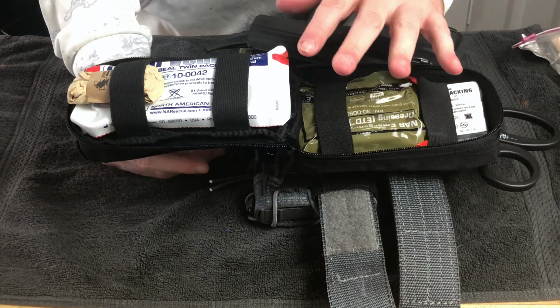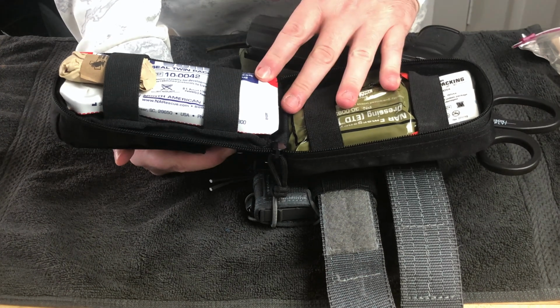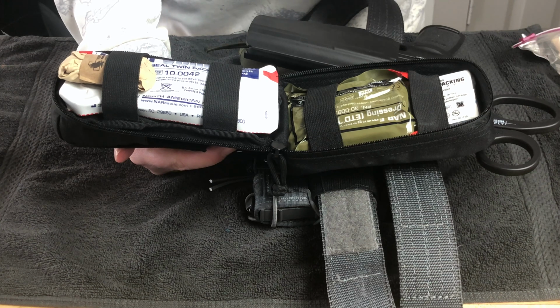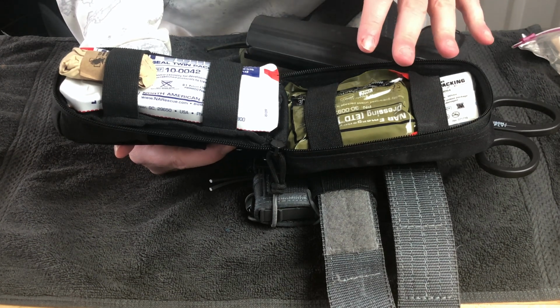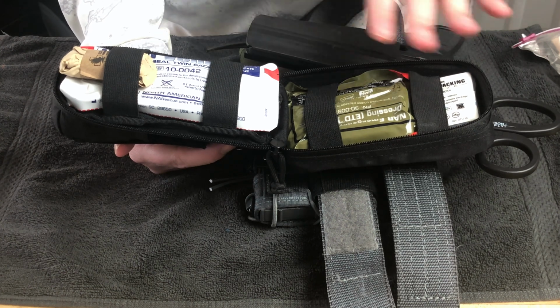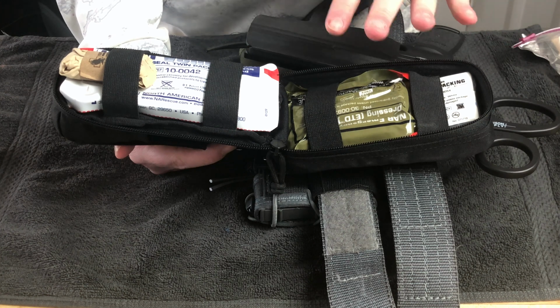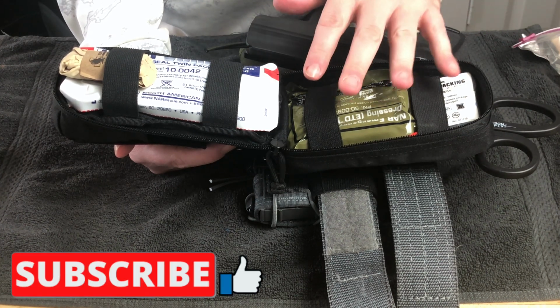This is a kit that is specifically designed for serious oh shit moments and nothing else. They do not care that you cut your finger with your knife a little bit. The only thing they care about is you're going to survive. That's it. Everything in this kit is centered around the person will live long enough for a real medic to get to them and help them.